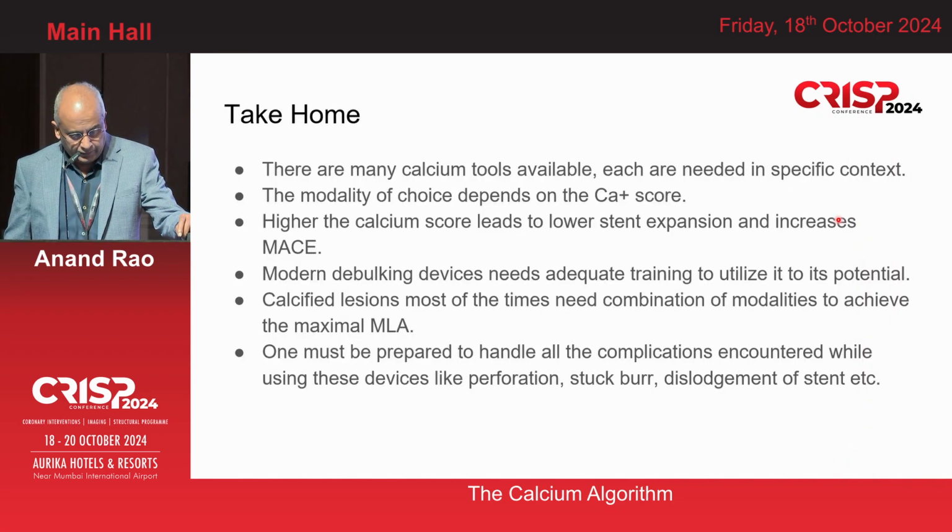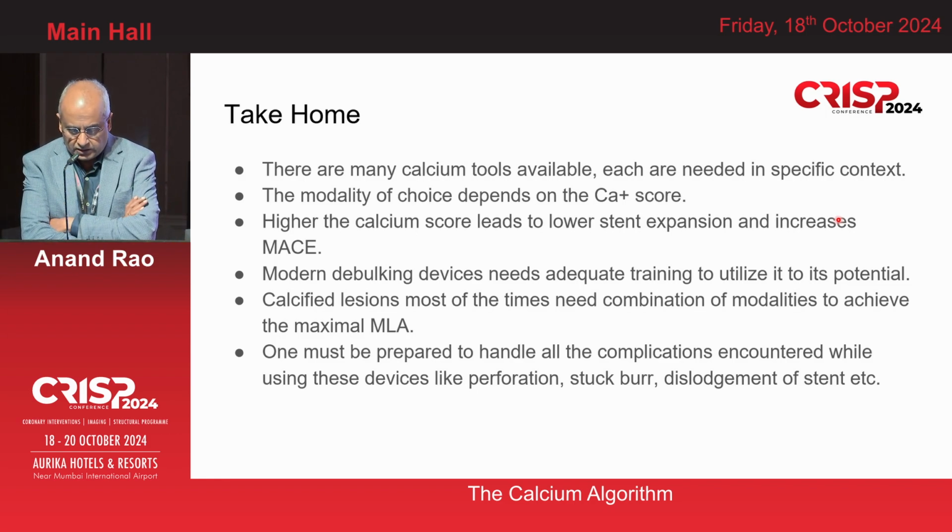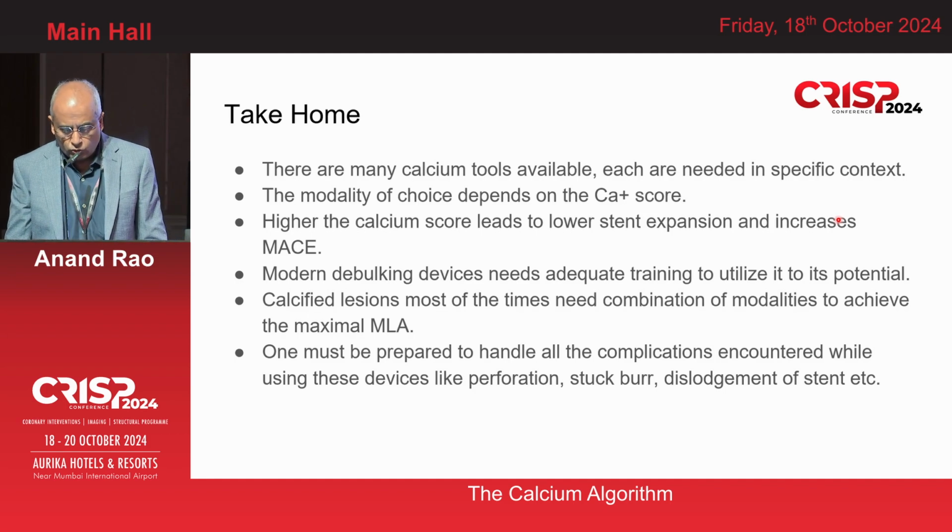I'll end with these take-home messages. There are many calcium tools available. Each needs to be addressed in a specific context. The modality of choice depends on the calcium score. A higher calcium score leads to lower stent expansion and increases MACE.